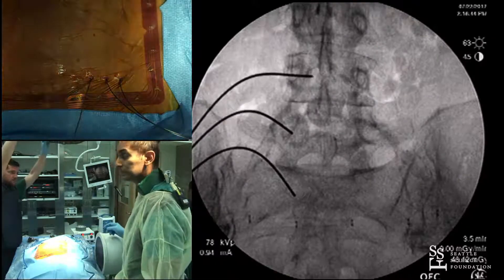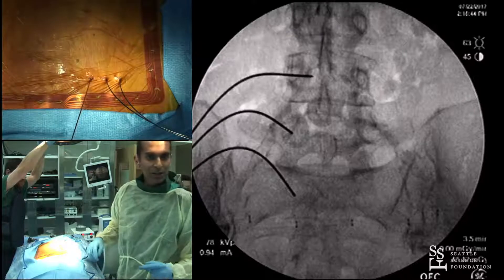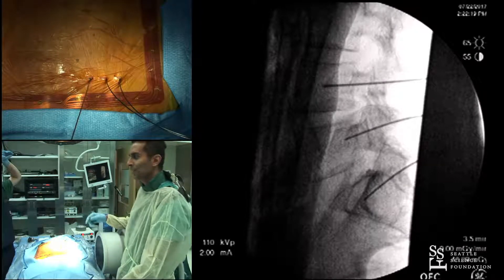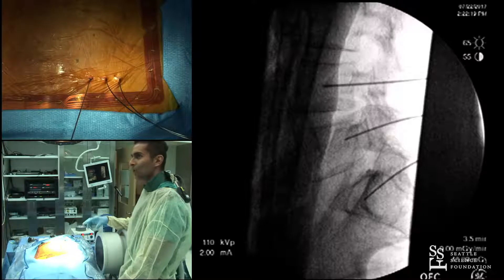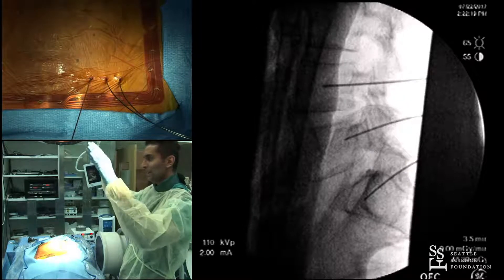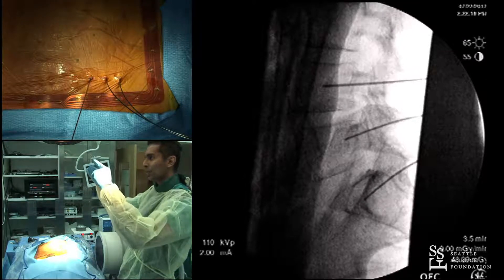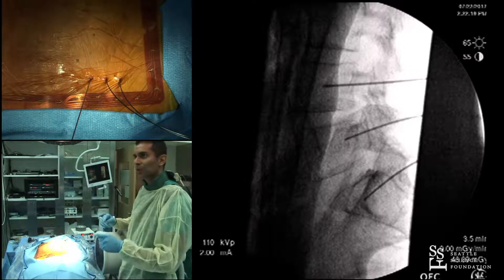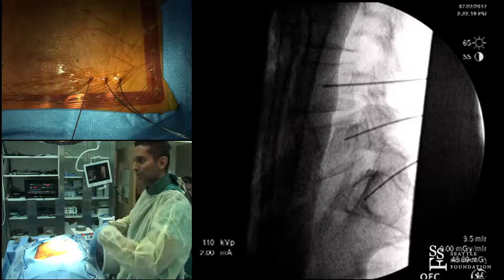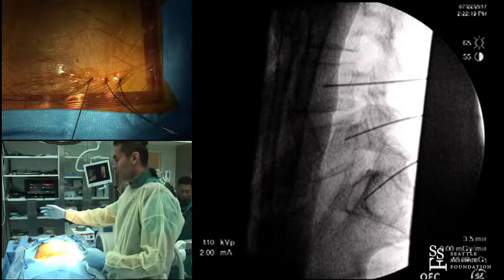For the S1 bicortical technique: on the AP view, the S1 pedicle looks like an ear — you see the medial and superior portion. I target the upper inner corner, which leads you to the sacral promontory. This screw is perfectly placed. You don't necessarily need tricortical fixation, but for a long construct like T10 to S1 where I'm not going to the pelvis percutaneously, I'll aim that S1 screw out toward the sacral promontory.